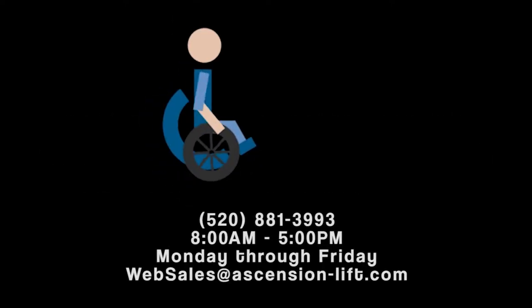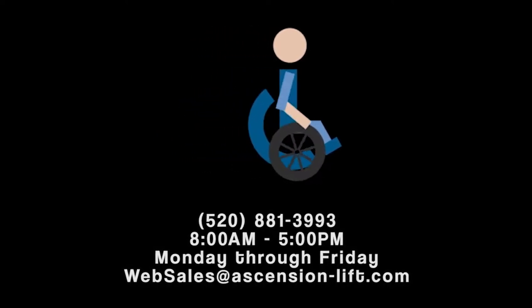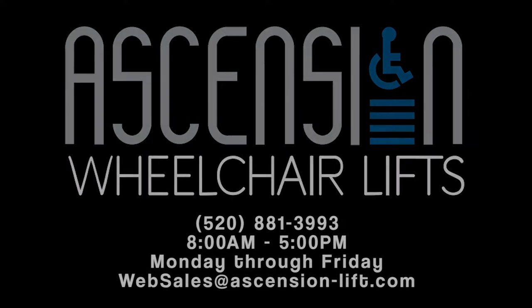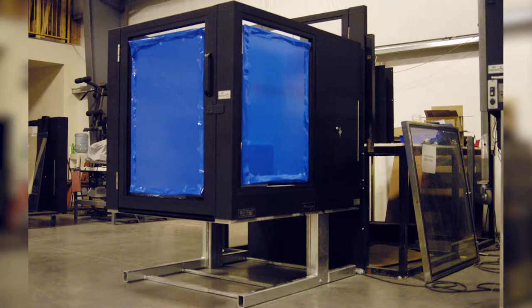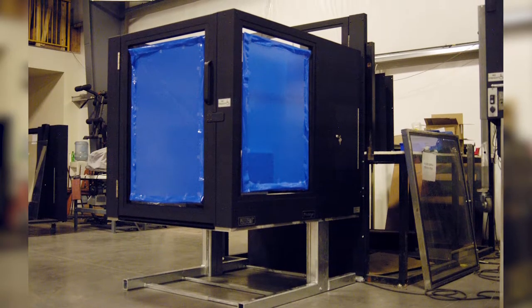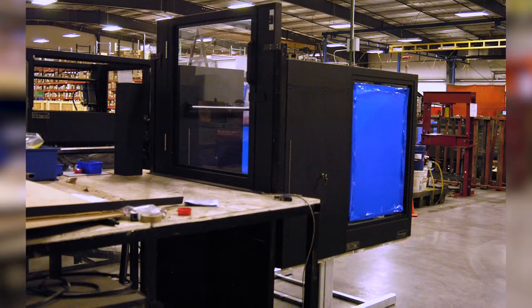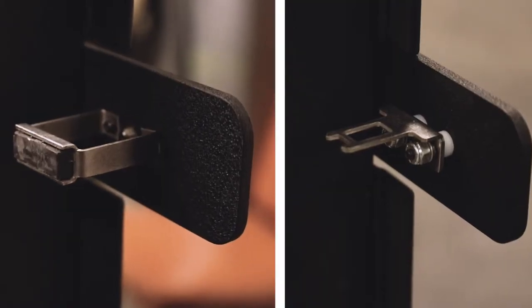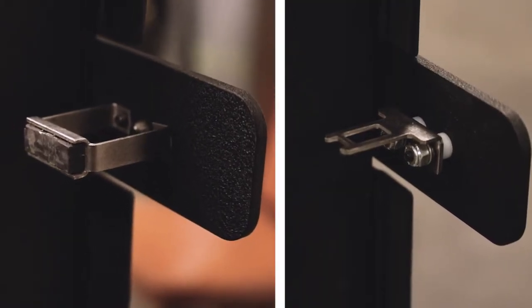If the problem is still not resolved after performing these basic troubleshooting steps, contact Ascension or your lift servicing company for troubleshooting assistance. The following provides a brief description on where the gate switches are located and how they work. The Protégé lower landing gate, and also the upper landing gate on fixed lift units, has different interlock assemblies depending on how old the lift is.